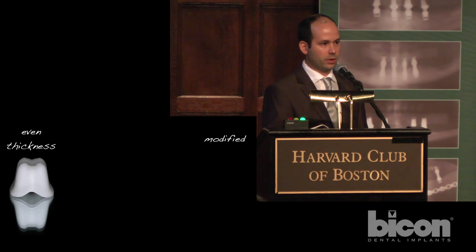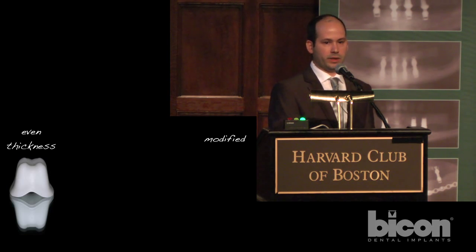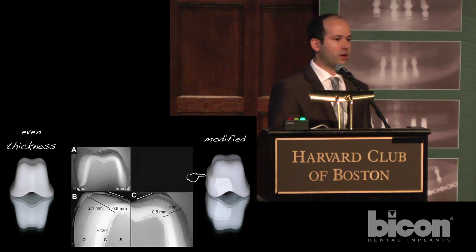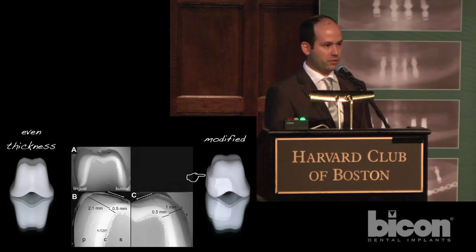Oh, yes, we do. If we don't tell the CAD/CAM machine, this is the default coping that we may have, regardless of the material that we're milling. So it is an even thickness coping. We propose to modify it because if you see a cross-section of a porcelain fused to anything crown, the technician will do the porcelain layering for aesthetics and function. And at the end, we may end up with a huge discrepancy in porcelain thickness that we will never know, as you can see from these slides.